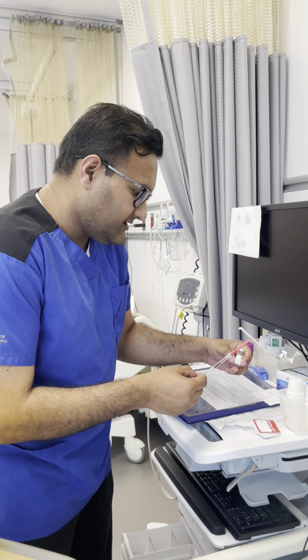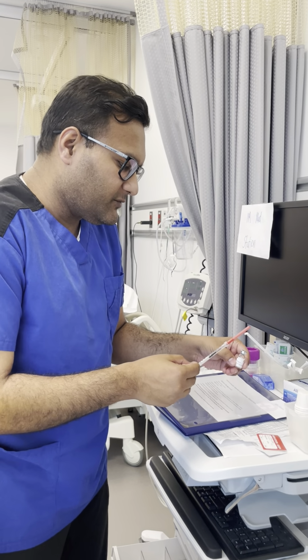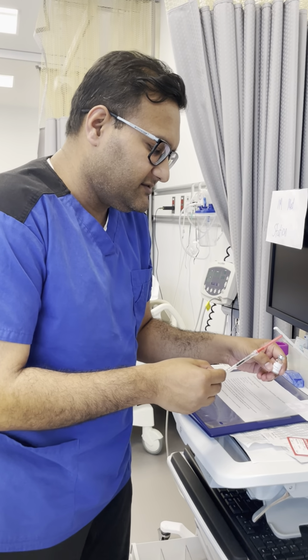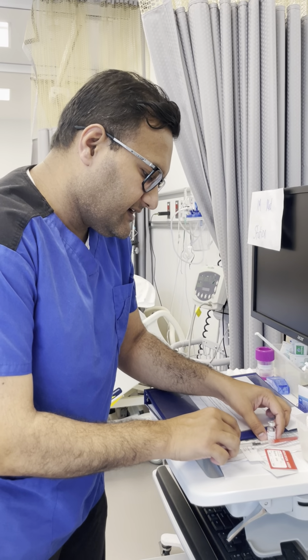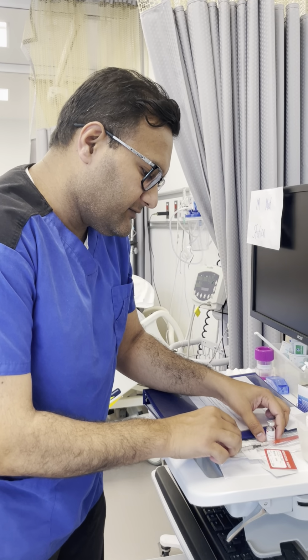And again, this is to ensure I have the right patient, right medication, right drug, right route, and right time. With that, I would then also put my label through. Hygiene before putting on my gloves. Even though I'm not contacting any bodily fluid, it's still advisable to put on gloves when administering medication.